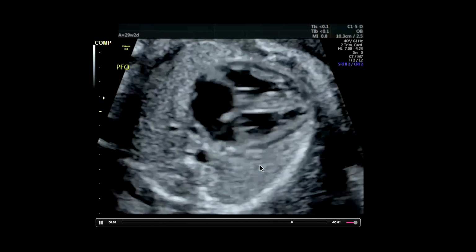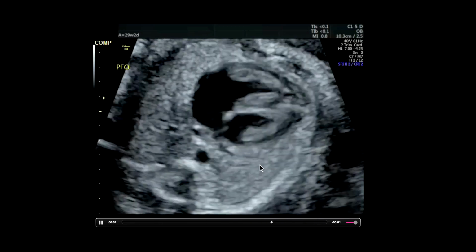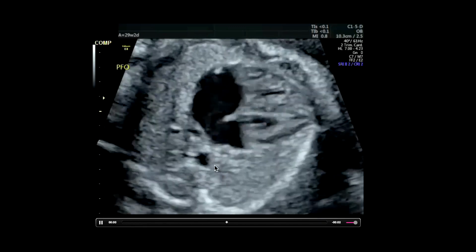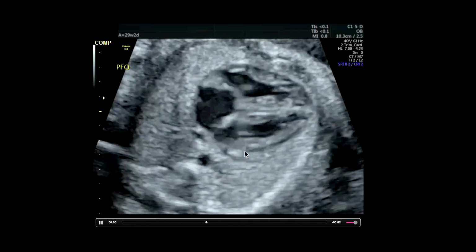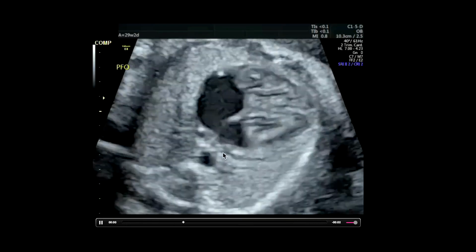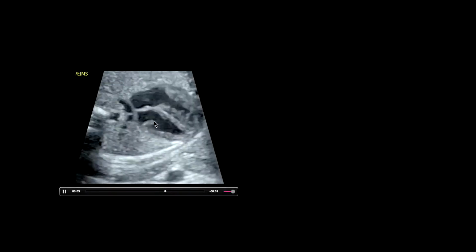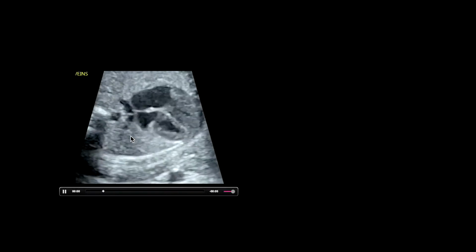Pulmonary veins, correct. So if you're going to take something home, it's definitely going to be knowing how to look for these pulmonary veins, right? Okay, so here's our descending aorta, here's our left atrial wall, so maybe a little bit of an increased space, but not quite seeing something in this plane. So repositioning again here, and now we can see our venous confluence behind the heart.